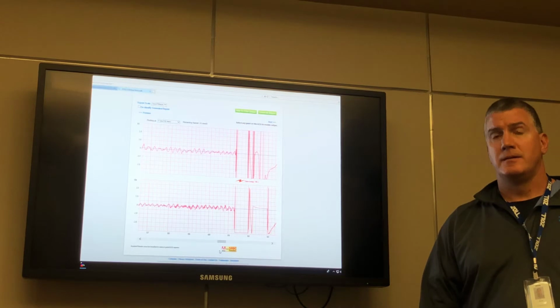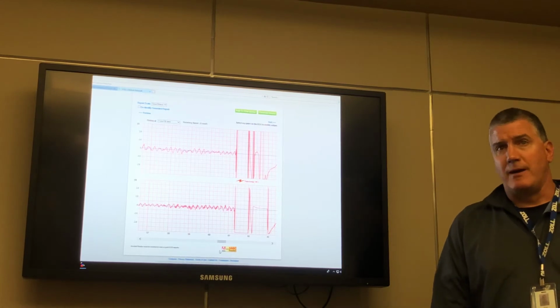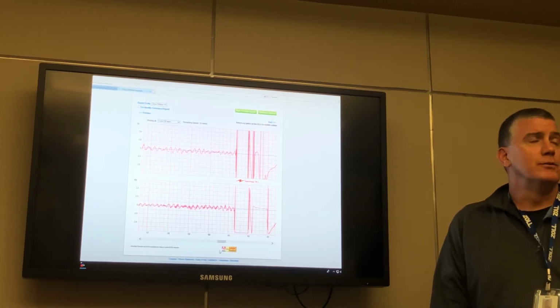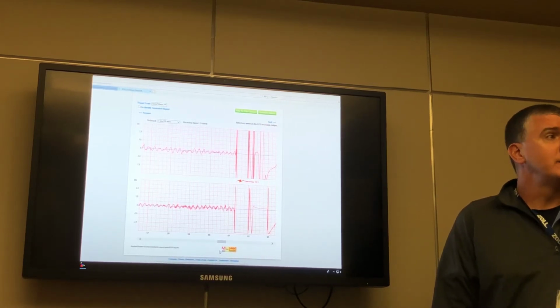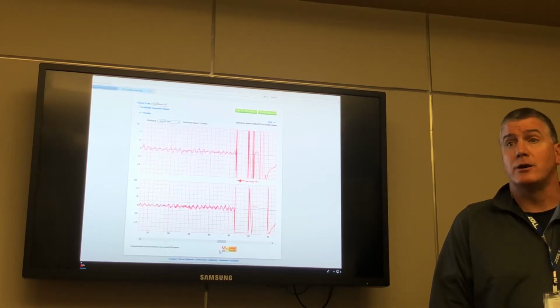Right. They could download it and you just talk to them and you'd put them on the system. Yeah, well, that's probably going to be a little challenging for the nursing staff, but they can always call us and we can send over the reports. Fax them over, or email them, like Courtney said. So right now, we're setting up providers, but if y'all have a question, call us and we can definitely get you the information.